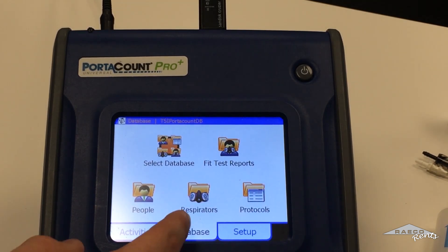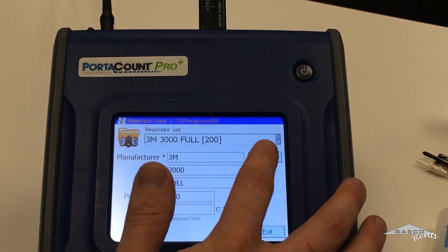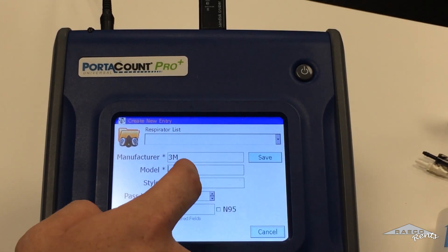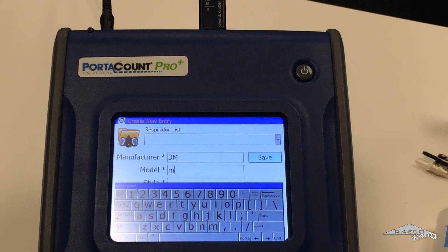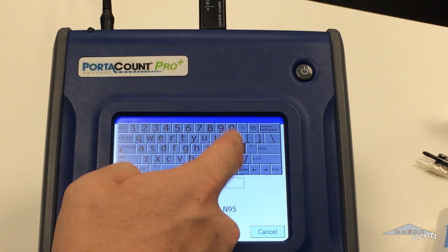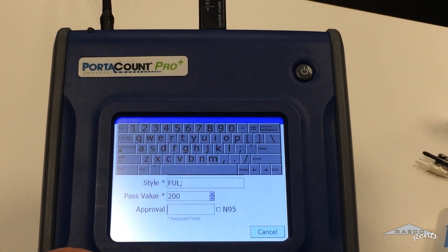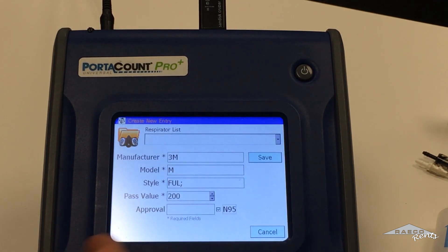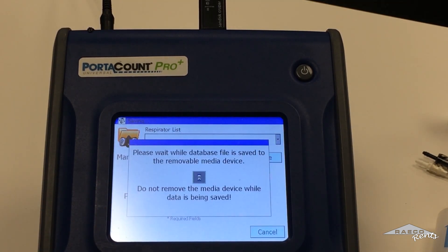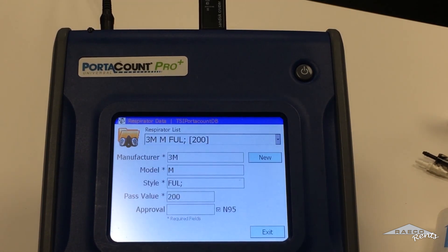So then we go back. We're going to do the respirators now. You can hit new and type in the info you need: your mask manufacturer, the model number, and the style — either full face or half face. We'll say this is full. And then if it is an N95 mask, make sure you check that box — it's real important. Then just hit save. Repeat this for any respirators that you have.